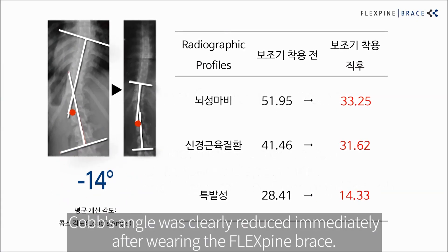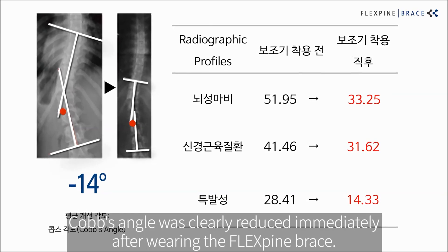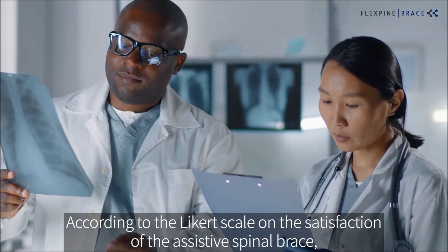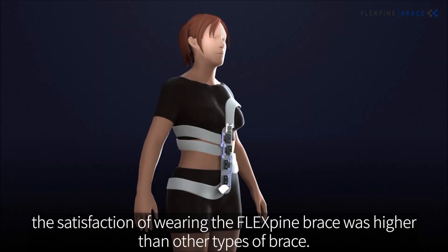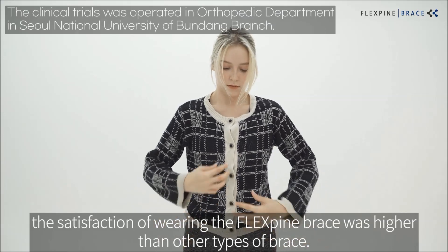Cobb's angle was clearly reduced immediately after wearing the FlexPine Brace. According to the Lickert scale on the satisfaction of the assistive spinal brace, the satisfaction of wearing the FlexPine Brace was higher than other types of brace.